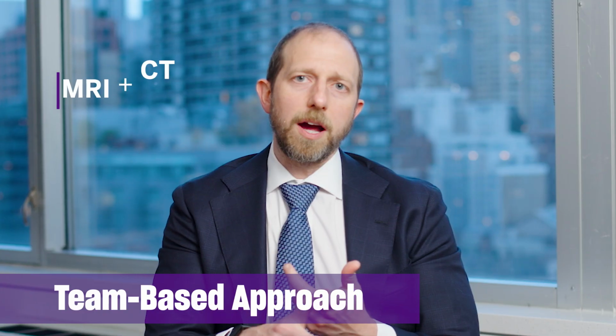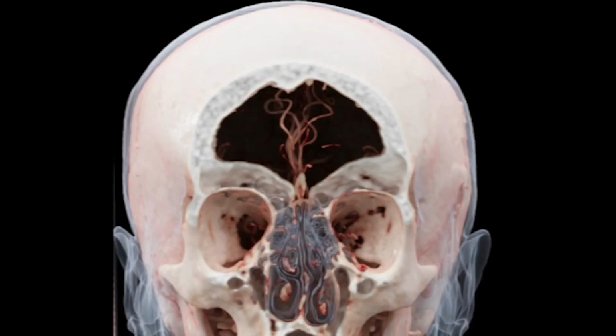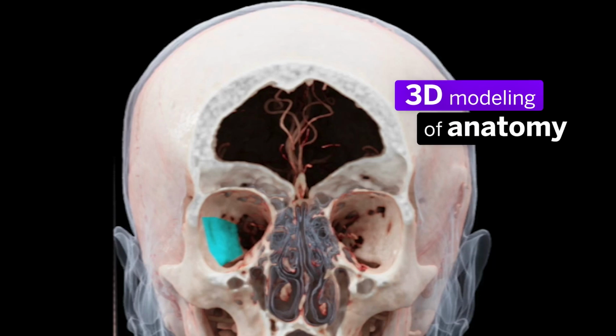Combining the MRI with the CT angiogram and putting those together and then creating our 3D model to go through and look at what does our window look like with each approach and which one will give us access to the entirety of the tumor, or at least the most important and impactful parts of the tumor. We put all that together and use that as our baseline for planning the approach.